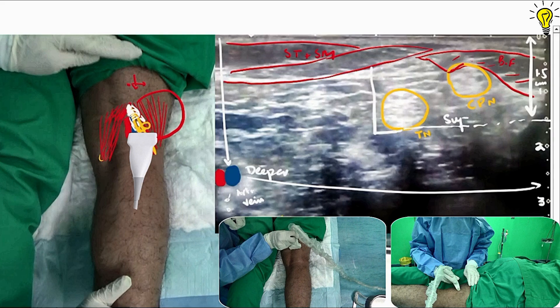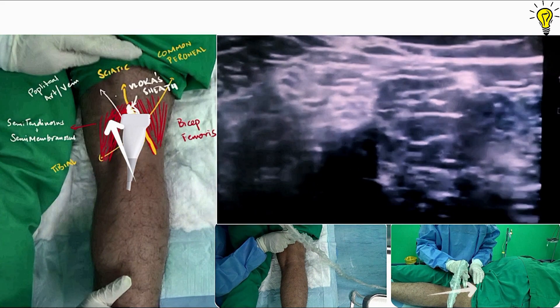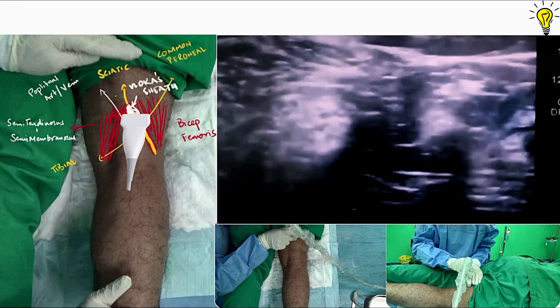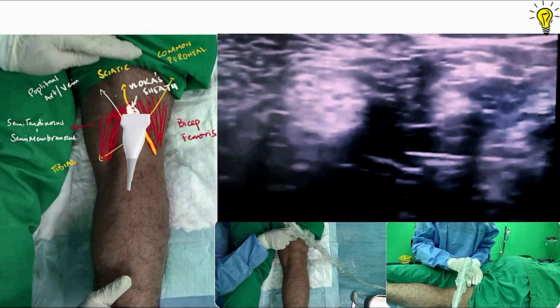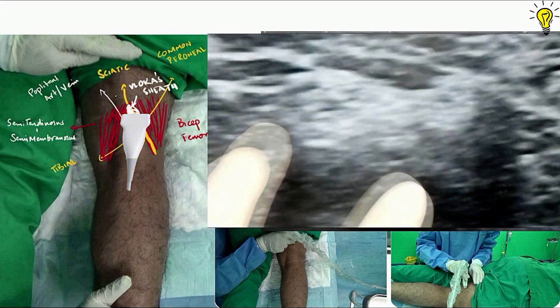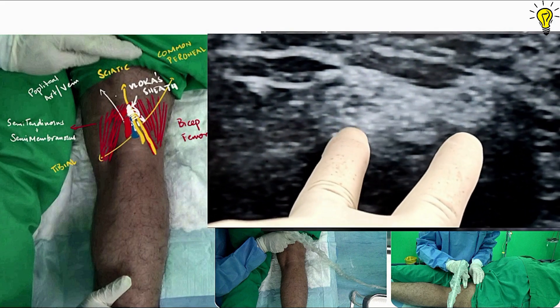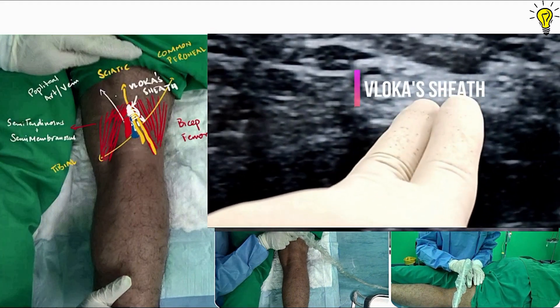The nerves are barely 1.5 cm below the skin surface, whereas the vascular structures are sitting quite deep — so you don't require a longer needle for this block when coming from the posterior approach. As I move the transducer upwards, I can see the tibial and common peroneal nerves converging until they become one big hyperechoic mass — the sciatic nerve. Moving the probe down again, right below the bifurcation, you can visualize a wide sheath covering around these nerves — this is the loose connective tissue sheath.